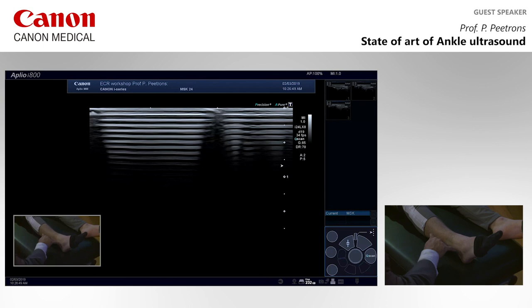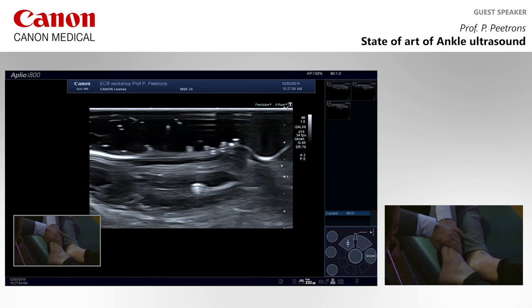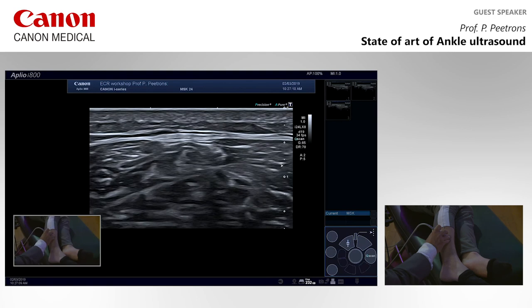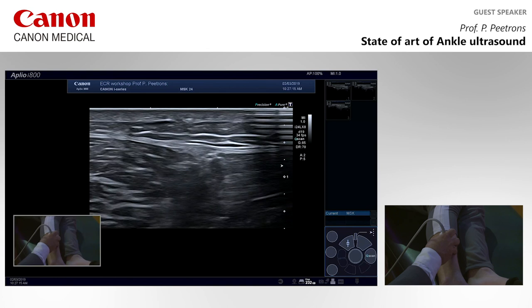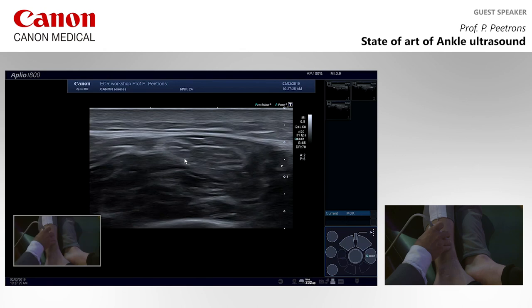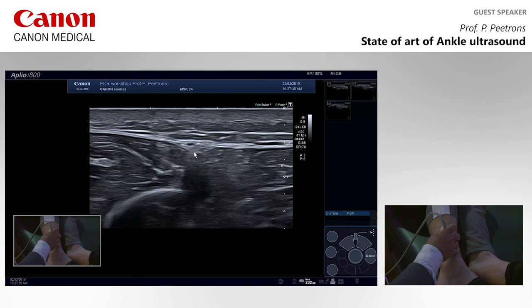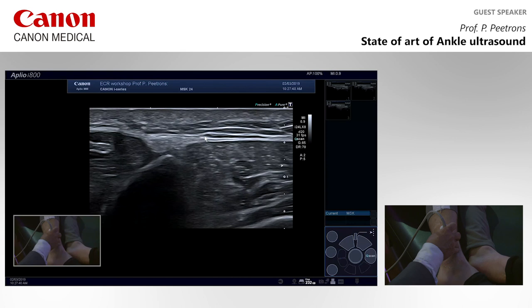Okay? So I put my probe 15 centimeters above the malleolus. Can you turn on your left side? Okay, put this here and that one there. Okay? So I put there 15 centimeters from the malleolus. Okay? What I'm looking for is the place where the peroneal muscles here, peroneus longus and brevis, that you know, and the extensor muscle, extensor of the toes, are close together to each other. And I'm looking just in between, and I see here this little superficial peroneal nerve very easily.